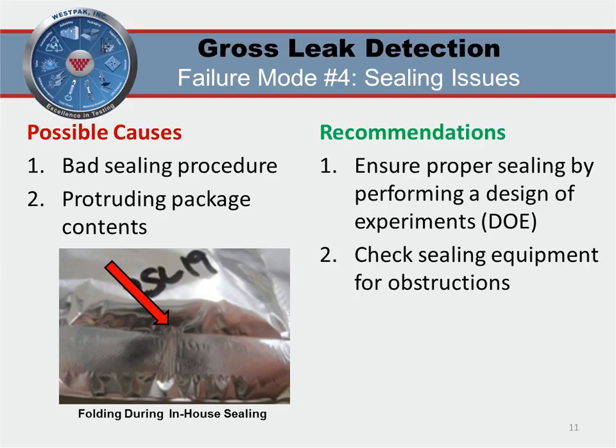Typically, we see a lot of pouch folding because generally it's hard to avoid, but a lot of the pouch folding we've seen, you fold it with the poly side inside. If you fold it the other way around, there's more chance of the poly material rubbing against your carton, which would probably cause more abrasion and probably result in a failure on the poly side of the pouch. Tyvek is a little stronger.